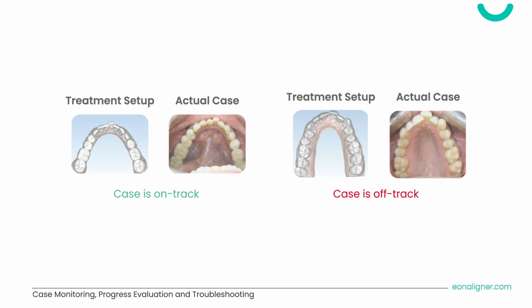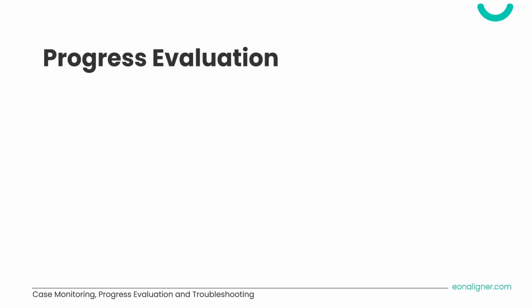Now, after the checkup has been done, you can evaluate the tracking. The term tracking is used for evaluating treatment progress, which refers to how well the aligners fit. Tracking can be perfect, good, or bad.